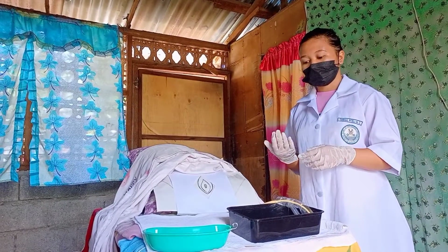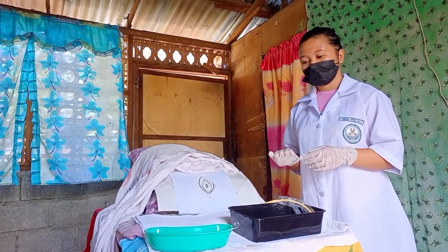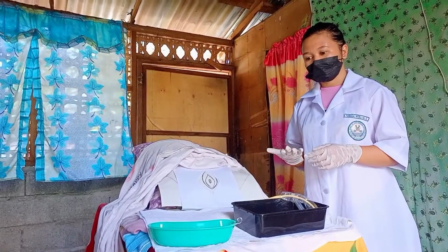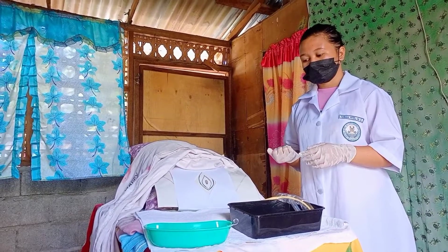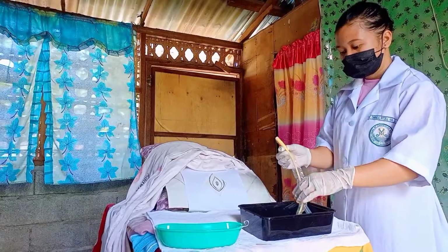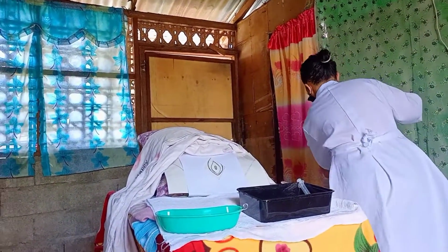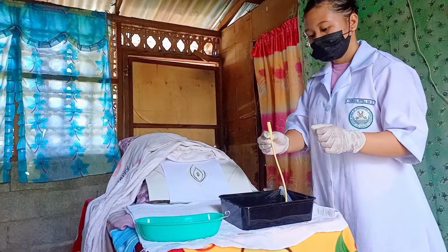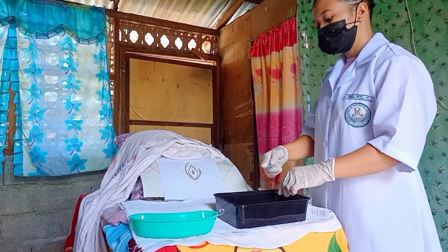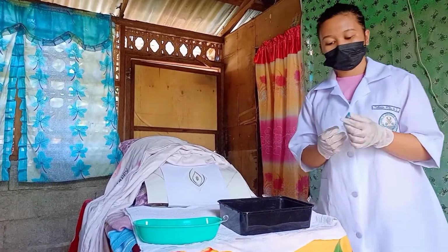For women, place the fenestrated drape over the perineum so that the hole is over the labia. For men, place the fenestrated drape so that the hole is over the penis. And also attach the pre-filled syringe to the indwelling catheter inflation hub, and test the balloon. If the balloon malfunctions, it is important to replace it.